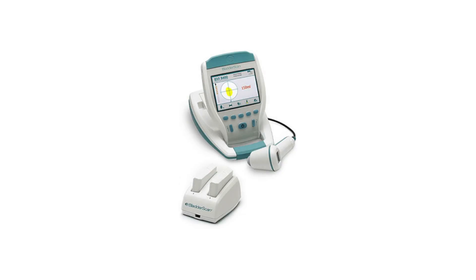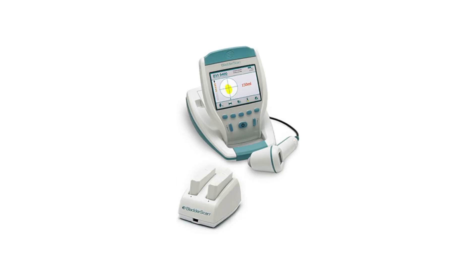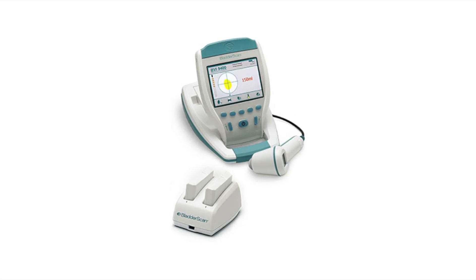No sonographer is required. The Verathon BVI9400's measurements can be printed via the onboard printer or transmitted to your facility's computer for viewing, printing, or archiving using HIPAA compliant scan point technology.